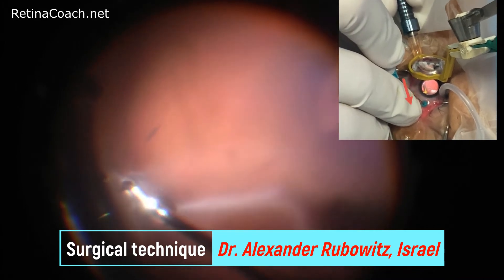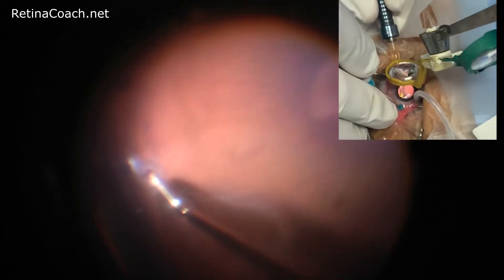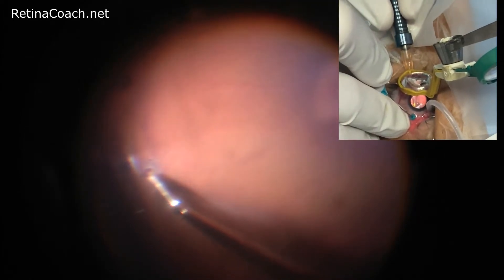Eye rotation toward the break facilitates maximal fluid drainage by creating a gravity-induced fluid shifting. The reflex between the air surface and fluid changes as the fluid needle tip enters the fluid meniscus. This can be used to assess whether there is remaining fluid still present in the vitreous cavity.